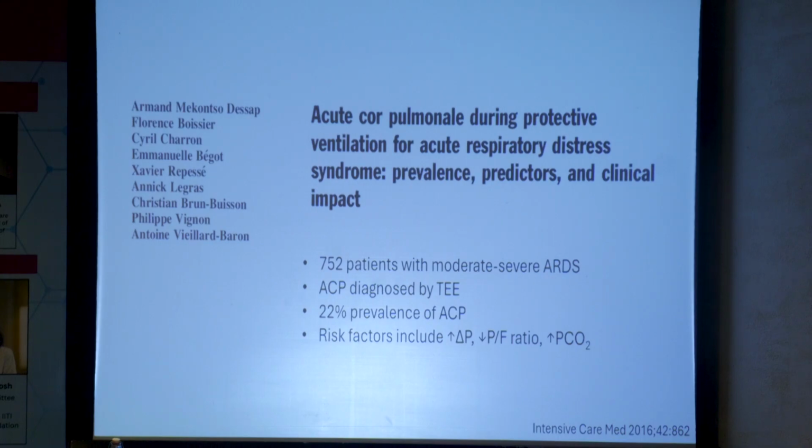Basically these have been approved for use in the United States for cardiopulmonary bypass type situations, yet clinically we and many other institutions use them for prolonged support for cardiorespiratory failure. I don't think there's any inherent limit, but I should say out loud that everything that I'm discussing here exceeds the FDA labeling of these cannulas in the US.